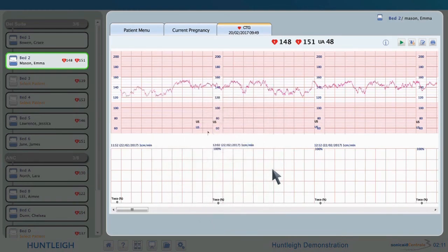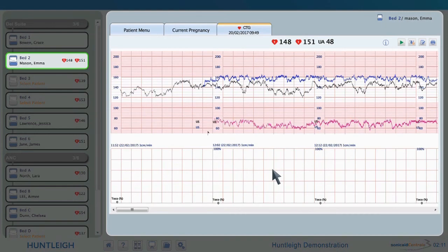The CTG trace shows a twins trace clearly and will also display triplets. Maternal information including SPO2 and NIBP from any suitable connected CTG. Traces are displayed in black for FHR1, blue for FHR2, and lilac for FHR3. Where these traces overlap, it is highlighted in red to make instances where the same foetus is being monitored twice easy to spot.